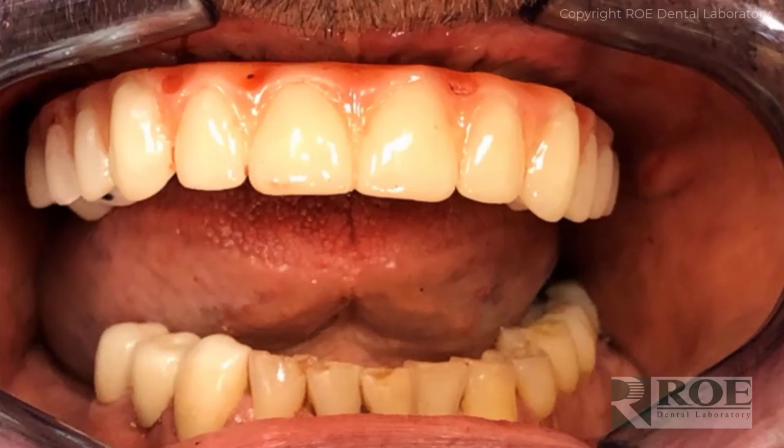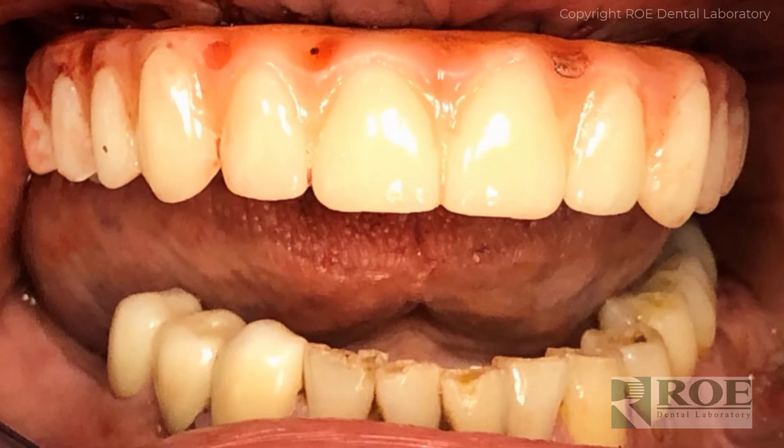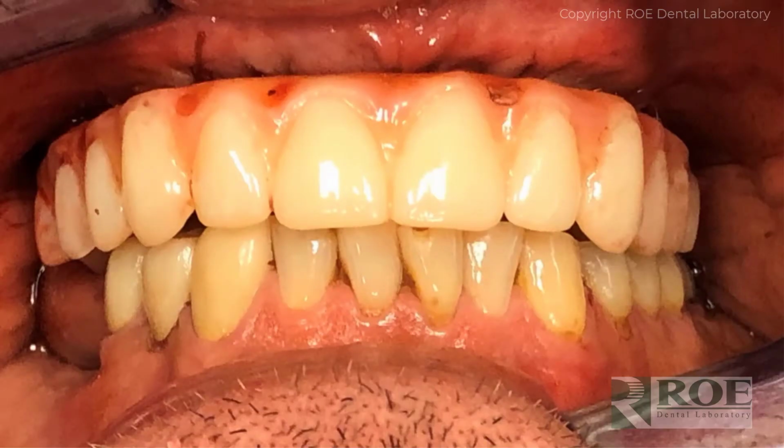So the sutures, and then the case is seated, and you can see it does look nicer here in the mouth. And a very nice result. Doctor did a really, really nice job here on this case. And the patient is equilibrated and dismissed.